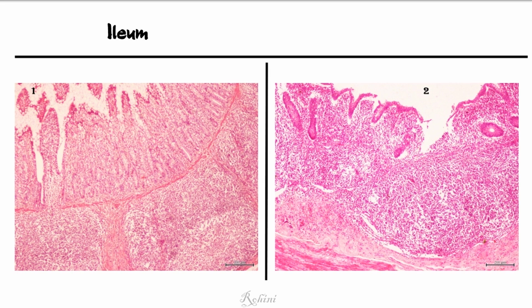Slide 2 is of appendix. Another clue to confirm it is the appendix is: take your eyes away from the eyepiece and look at the slide on the stage of the microscope. In the case of appendix you can see a complete circle with a lumen.